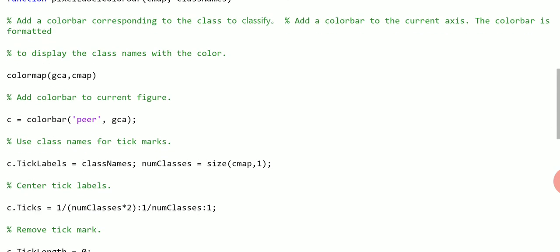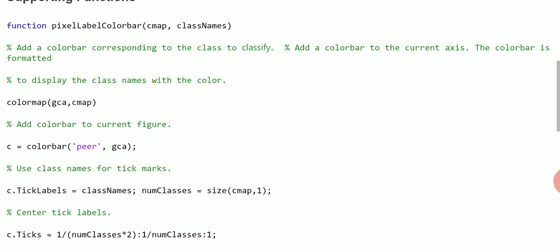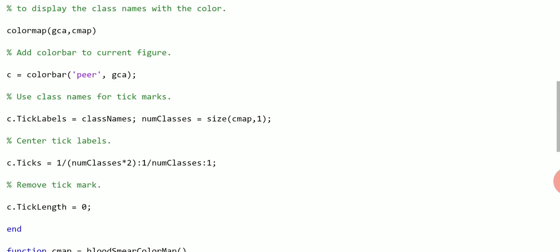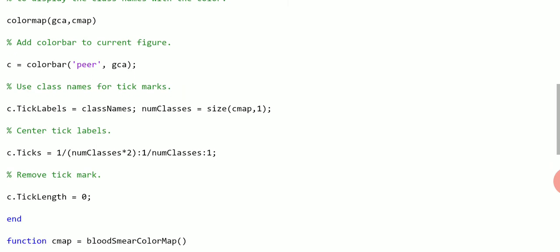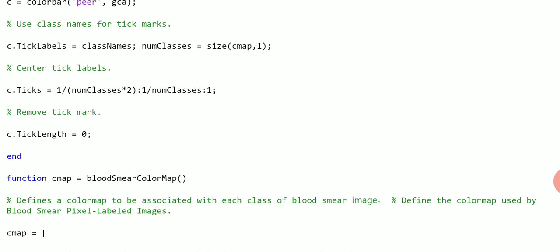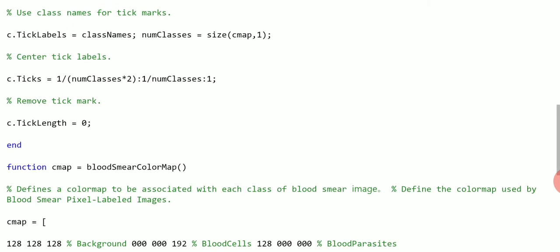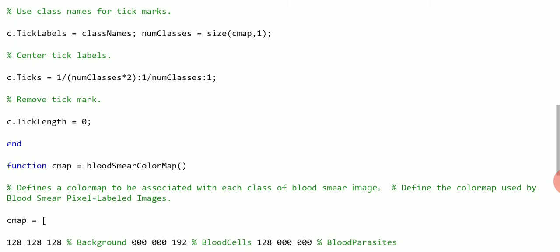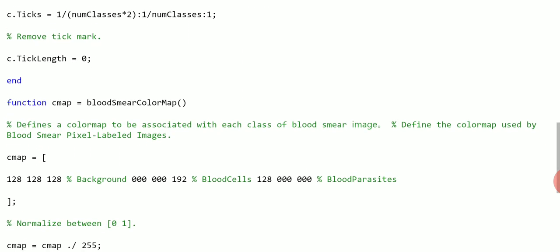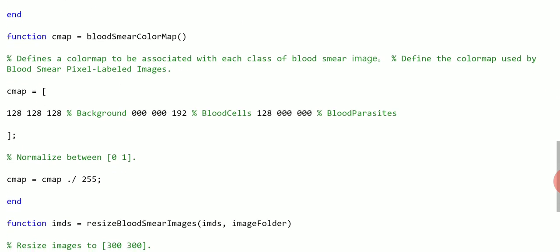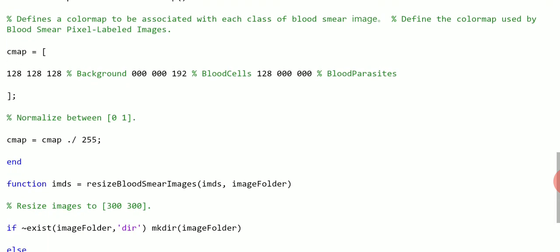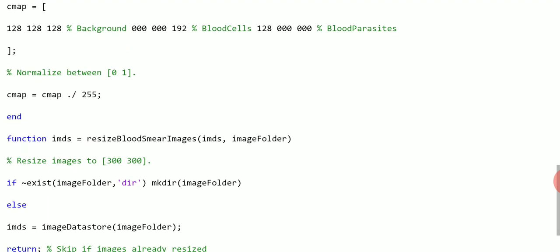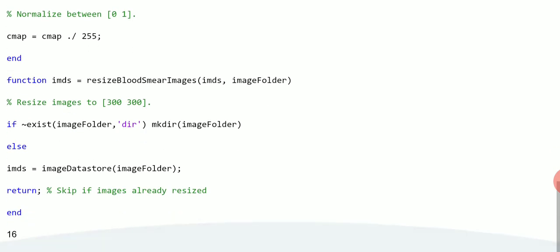There's some more supporting functions that were used back there. Might have gone a little fast, like pixel color, pixel label color bar. They were used previously. I can't remember on page 2 or page 3. There's another function, CMAP, that's color map. We're using for the blood smear color map. There's a resize blood smear. Remember the images were very large, so we had to resize them.